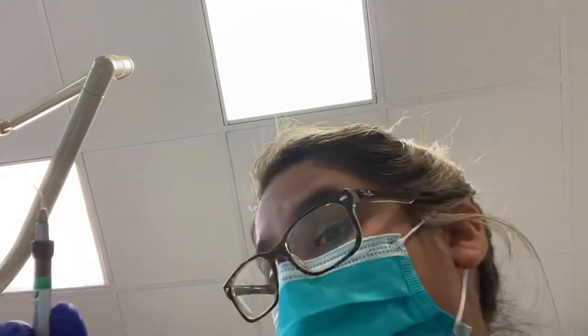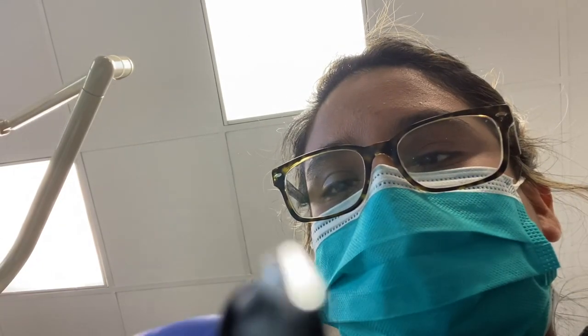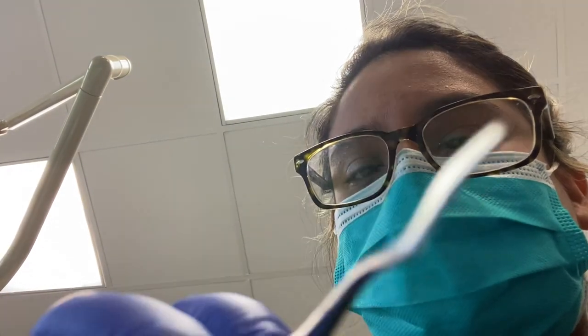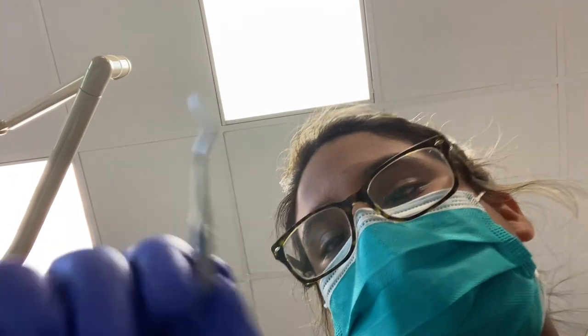And then, not a needle — comes right out of the tube. And it's just the white filling. It's just going to go like this. Only a little bit, because it's a tiny one. And then let me just pack it and kind of clean. And then I'll cure it again. Perfect. Perfect.